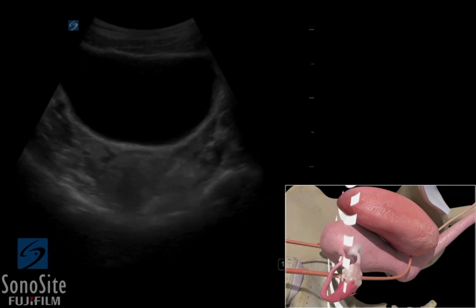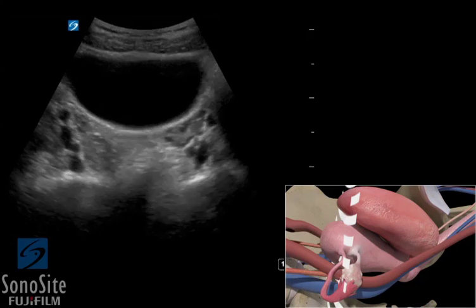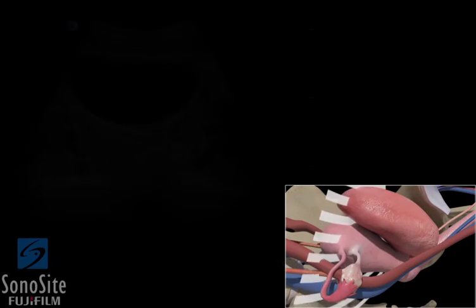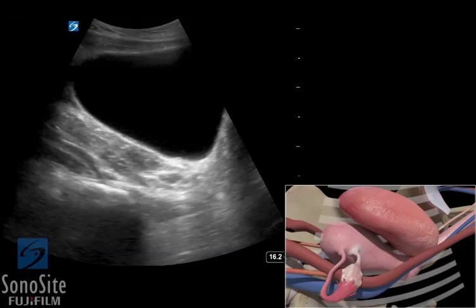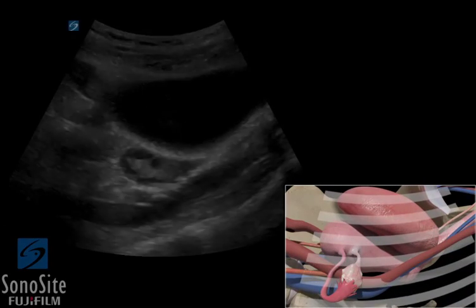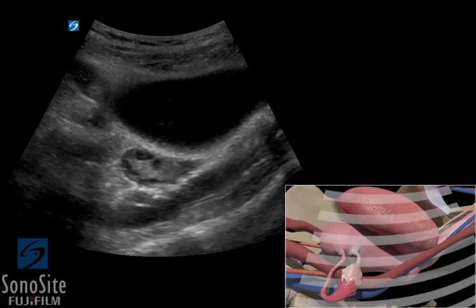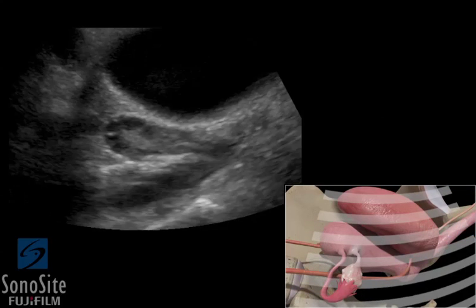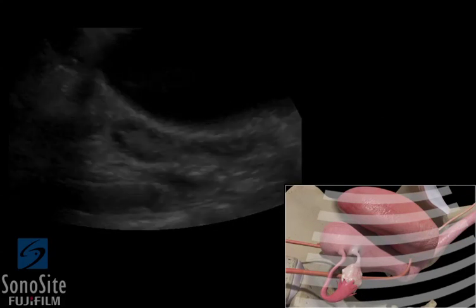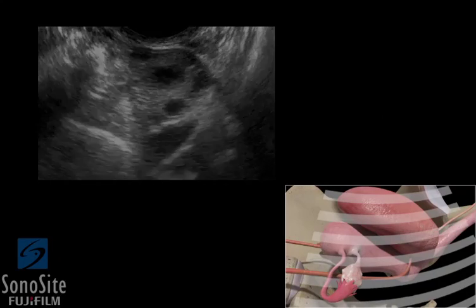If no evidence of an intrauterine pregnancy can be seen, the adnexal structures can be evaluated for signs of an ectopic pregnancy. The transducer should be slowly swept to the lateral aspects of the pelvis. The ovaries appear as round or oval-shaped hypoechoic structures and are often located anterior to the iliac vessels. Follicles may appear as multiple hypoechoic cystic structures within the ovaries. Some follicles may be quite prominent, depending on the luteal stage.